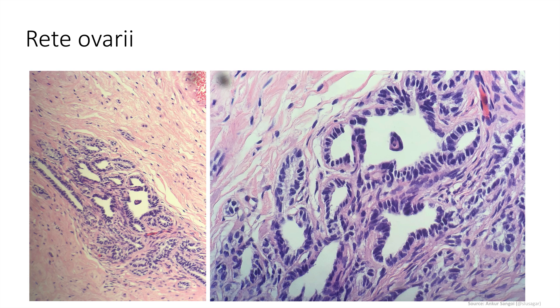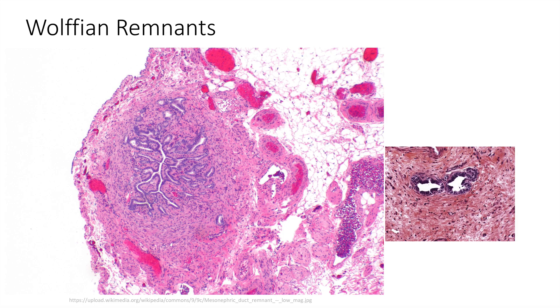These are rete ovarii, which are analogs of the rete testis and are present in the hilum of the ovary. They consist of a network of irregular clefts, tubules, and cysts with flat to cuboidal to columnar lining. These are Wolffian remnants, also known as mesonephric duct remnants. These are usually a small duct or clustered glands around a small duct. They have scant cytoplasm and no cilia, and the lumina can contain secretions which are usually bright pink.